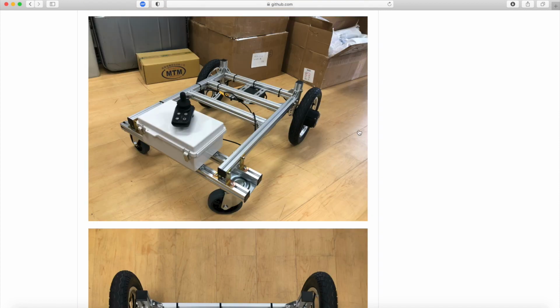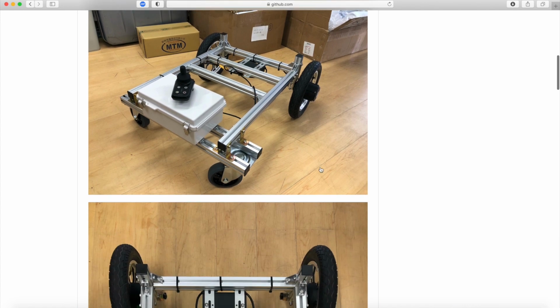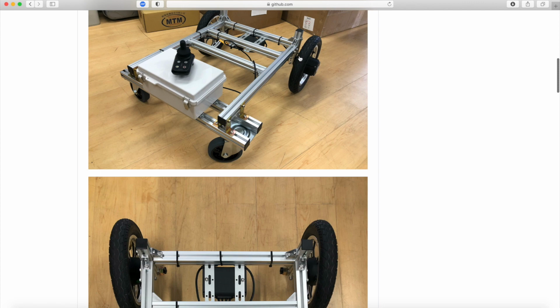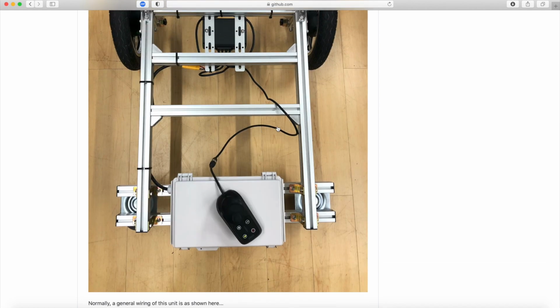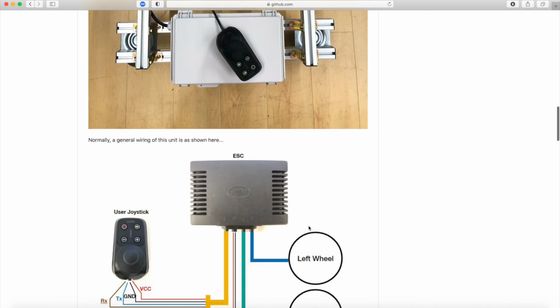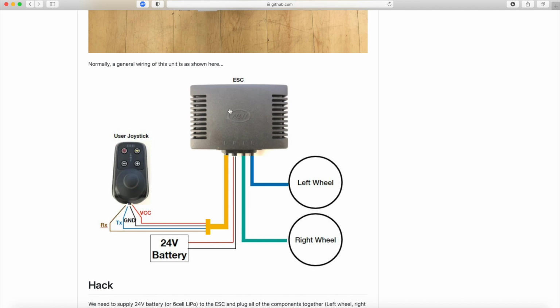You can see that the wheelchair motors can also be used as a robot cart, like this configuration. It's just a simple aluminum frame with brackets attached to the shafts of the motors. This is a top view, and you can see it still connects with the joystick, but I'm going to show you how to use a microcontroller to control it instead. Here is the default setup of the wheelchair. You have the joystick and the two motors, left and right wheels, and you also need a 24 volt battery, all connecting to the black ESC.